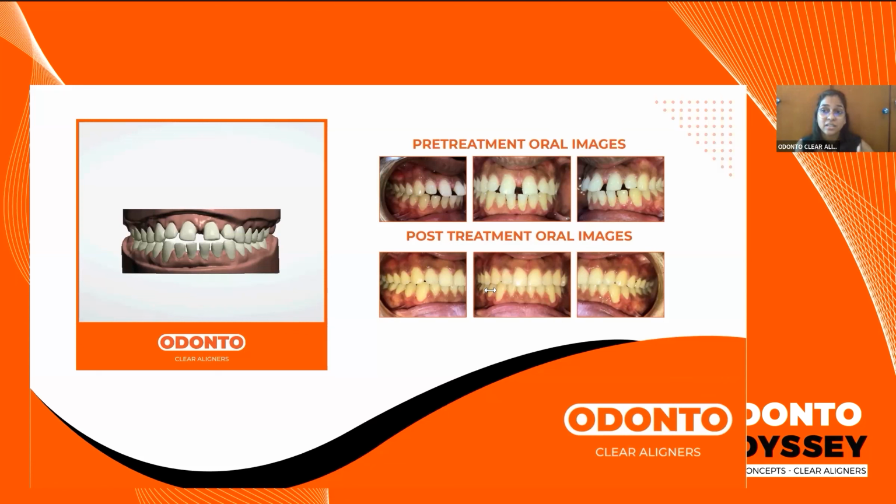Because if you have done lesser proximal reduction, you can always add to it. But if you don't do it properly and you do it at an angle, or you reduce extra tooth material, then obviously it throws your entire plan off. You can use either the strips, the oscillating strips that are available, or you can use a burr. You can go in for either of those depending on your comfort level.